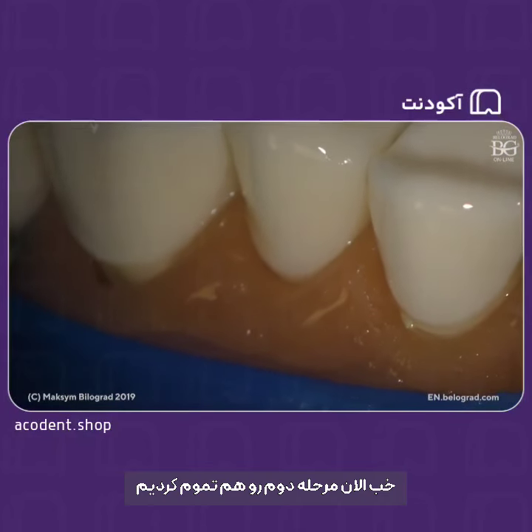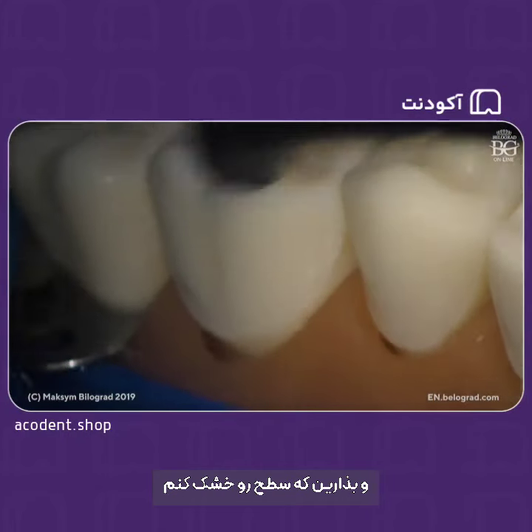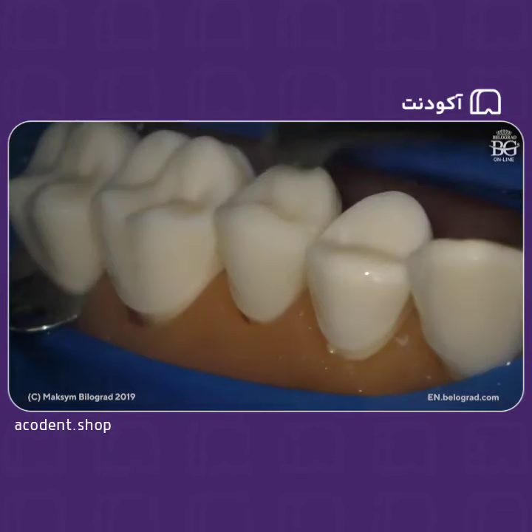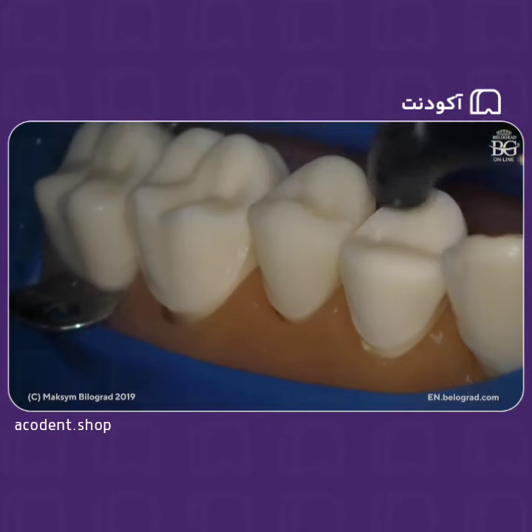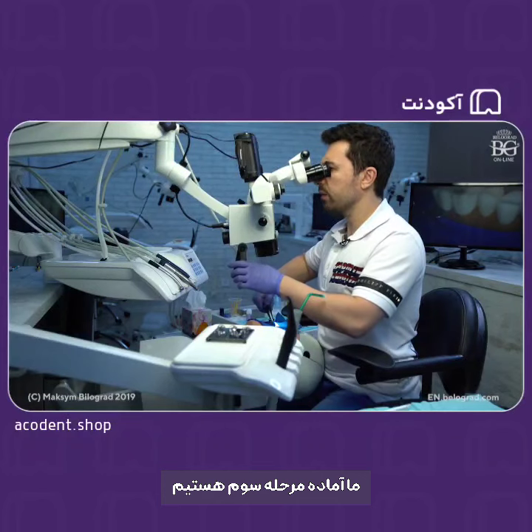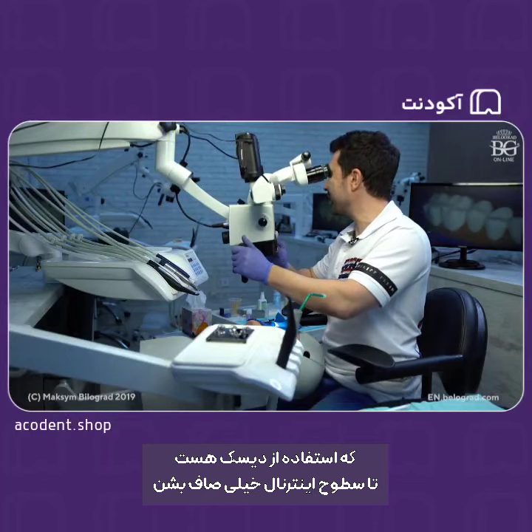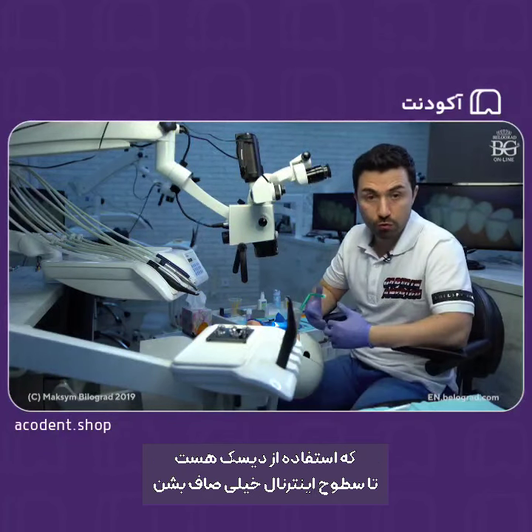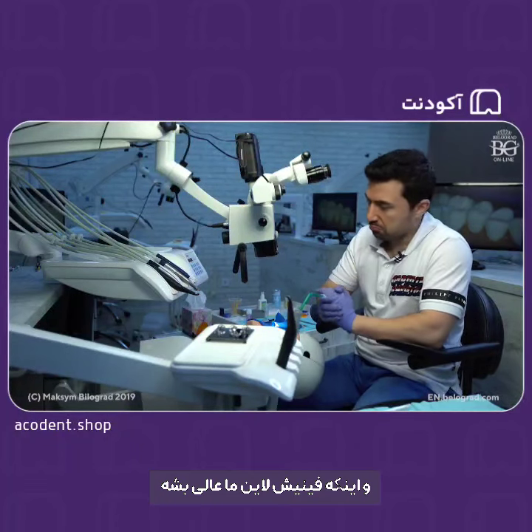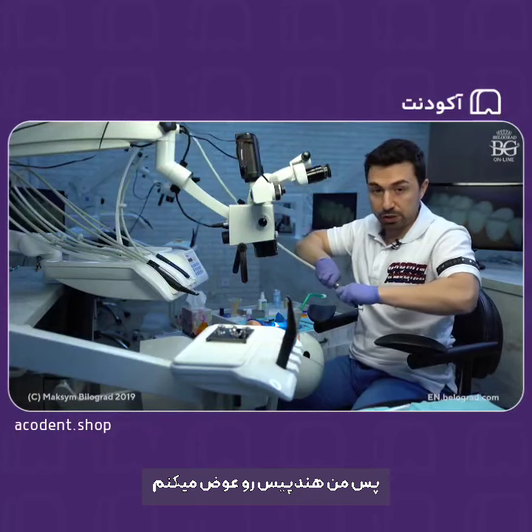Okay, fine. So basically we finished step 2. Let me dry and see. Step 2 done, and we are ready for step 3, which will be disc, just to make all internal surfaces super smooth and to make our finish line perfect. Okay, so I'm changing my burrs, I'm changing hand pieces actually.